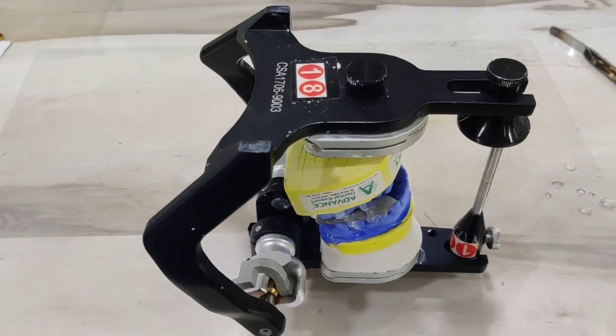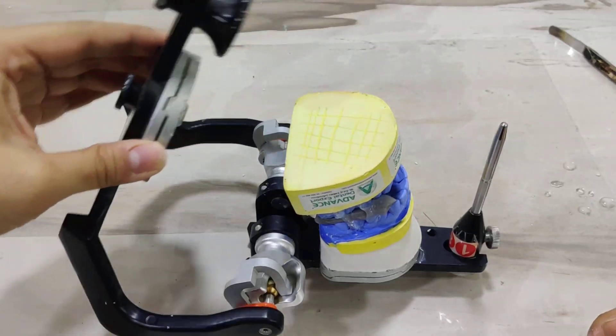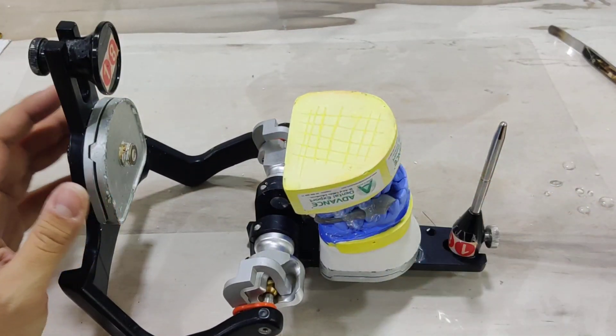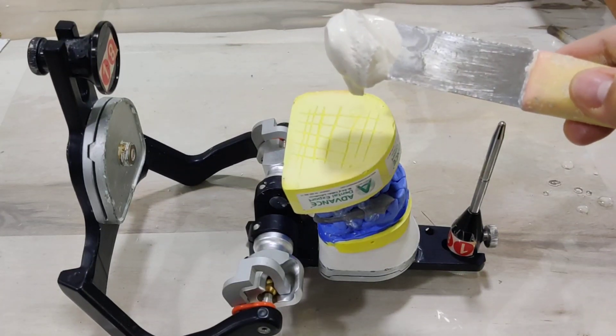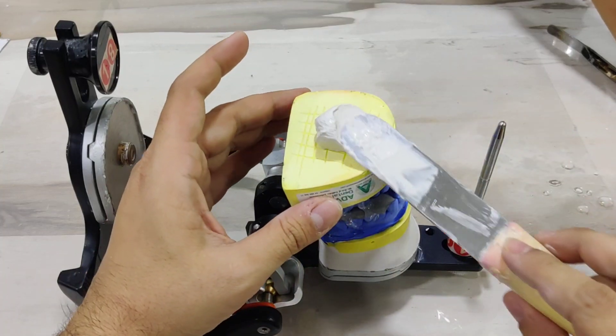We're now ready to mount the mandibular cast. The same rules apply here as well — make sure this is nice and wet before you proceed. When you have your plaster mixed and ready, the plaster should be of this particular consistency where it does not slip off when you turn it over, but it's nice and creamy.